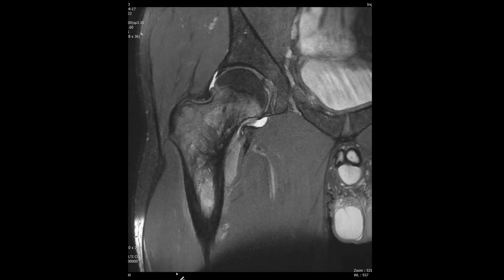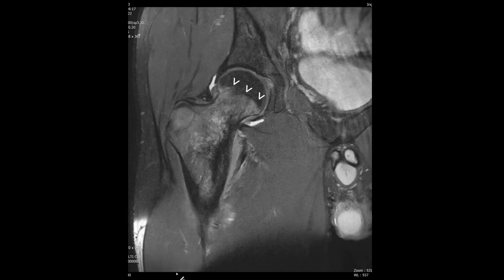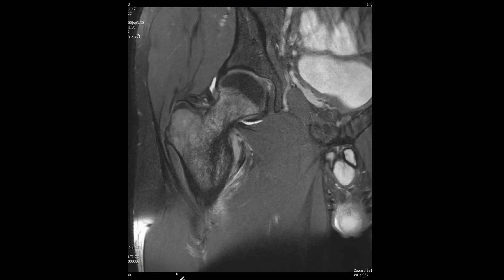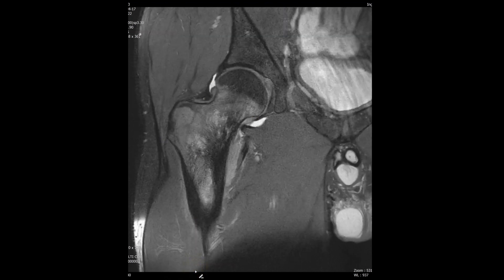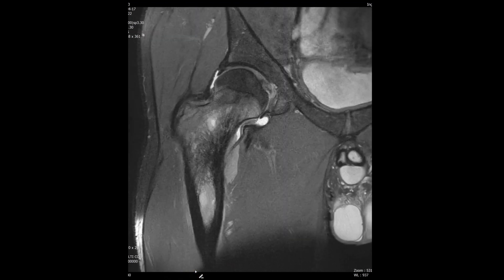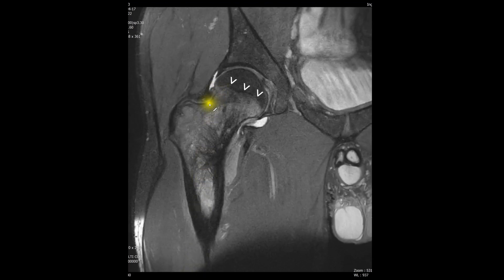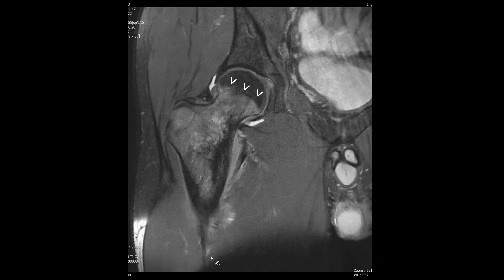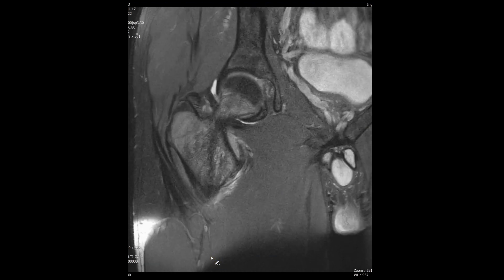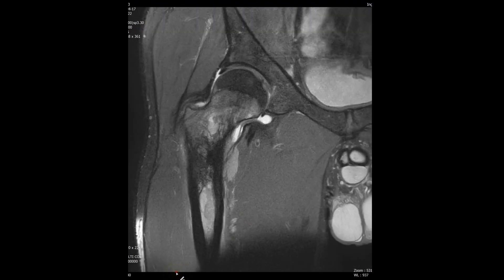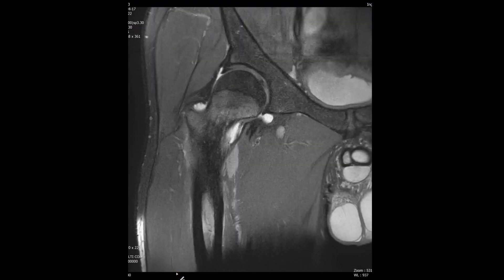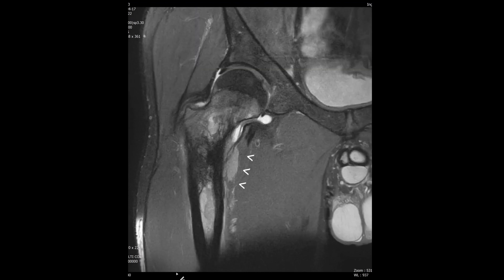Coronal 3D imaging shows that the epiphysis remains uninvolved despite extensive marrow involvement in the femoral neck, intertrochanteric region, and proximal femoral shaft. Interestingly, although the patient is 28 years old, the plain radiograph shows an unfused growth plate at the femoral head. In young adults with open physis, the growth plate acts as a partial barrier to tumor spread, which may explain the lack of epiphyseal invasion. This image also demonstrates the transperiosteal spread of the tumor with penetration into the adjacent soft tissue.